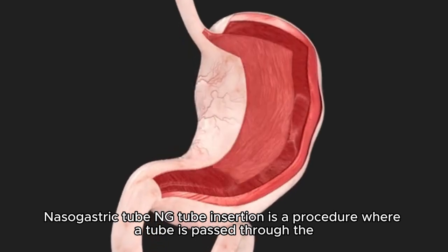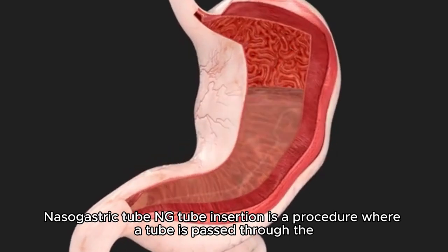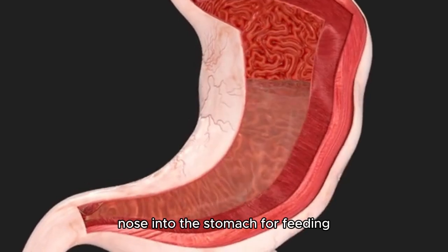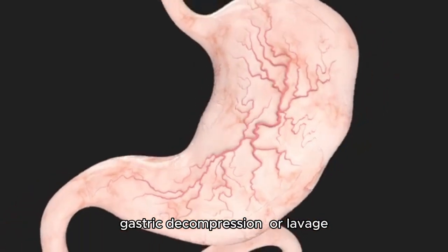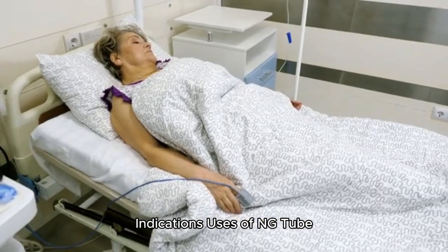Nasogastric tube (NG tube) insertion is a procedure where a tube is passed through the nose into the stomach for feeding, medication administration, gastric decompression, or lavage. Indications: uses of NG tube.